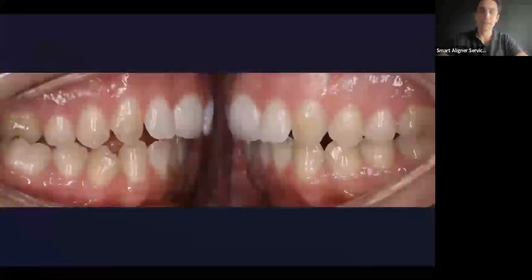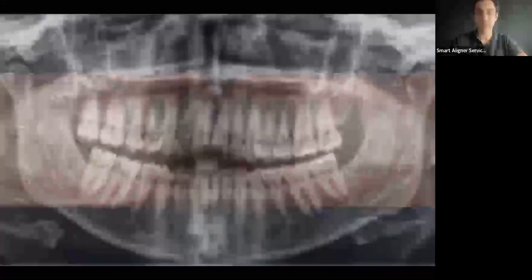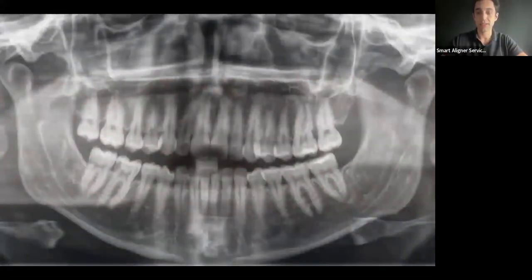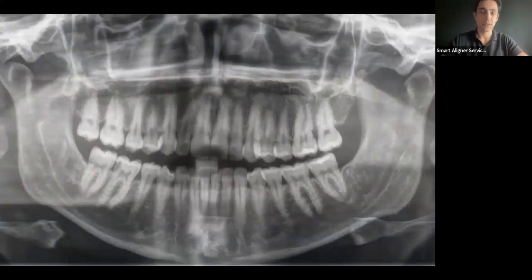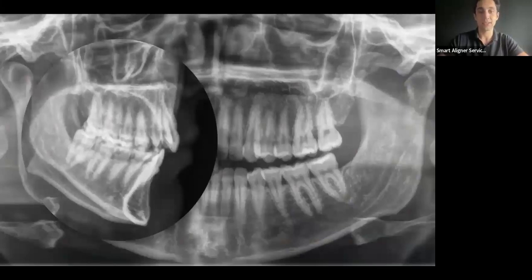The lateral pictures show that the patient has a Class 2, an asymmetric Class 2 related to the crossbite. Checking the x-rays, we don't see anything special - no appliances - so we can distalize with no extractions. On the lateral x-ray you can see the skeletal Class 2 of the patient. This augmented overbite is also related with the skeletal discrepancy.